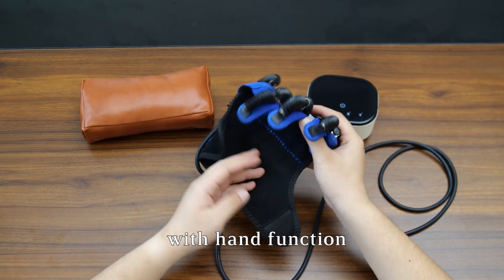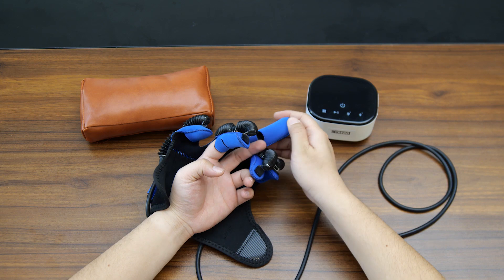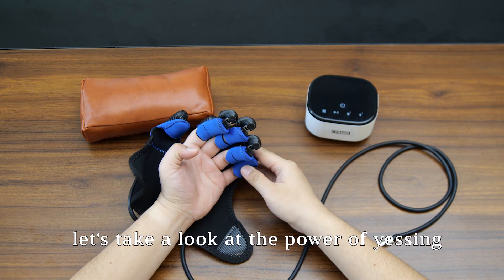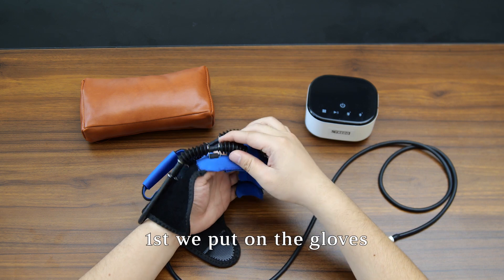This glove can help restore hand function to patients of all ages with hand dysfunction, such as inability to move their hands on their own, stiff fingers, hand oedema, and finger inflexibility. Let's take a look at the power of Yisheng.